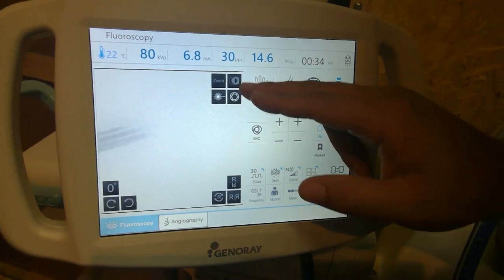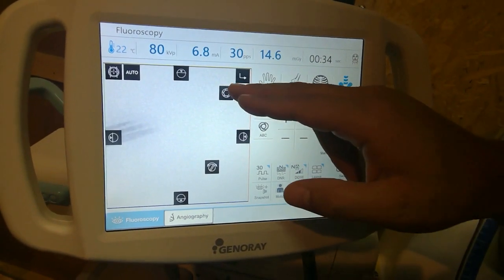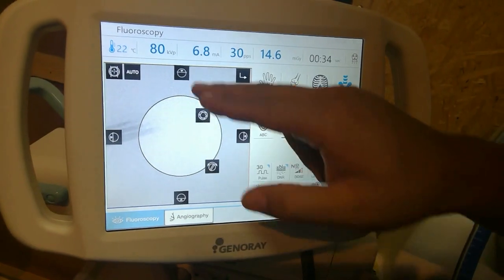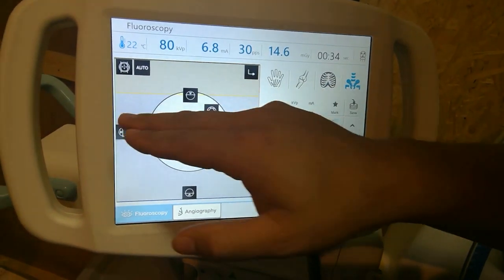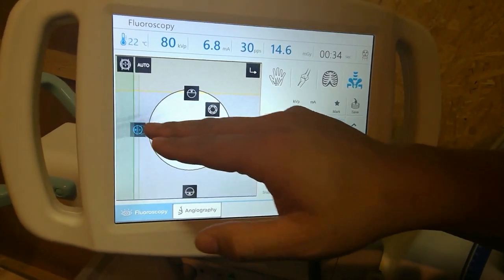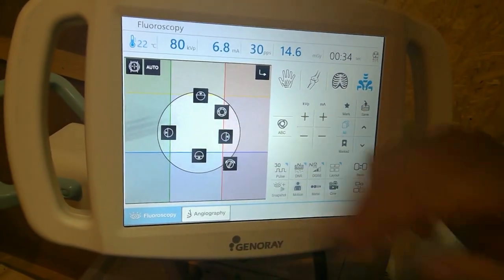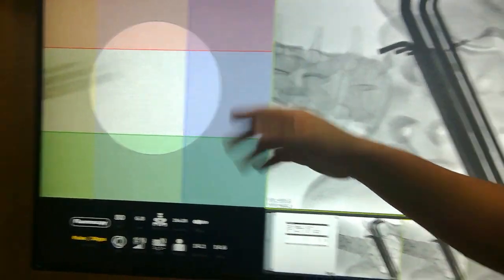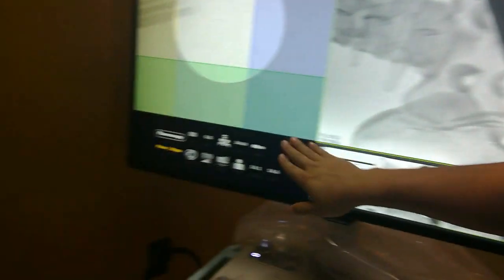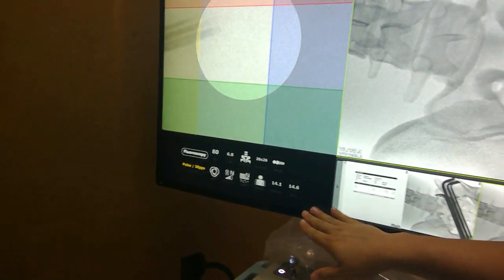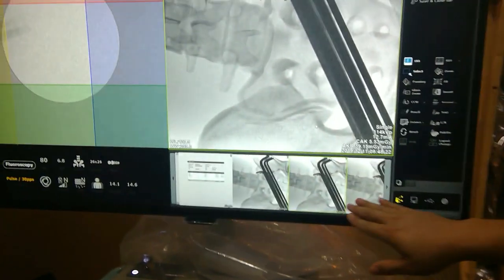One unique thing about this system is the collimator. This collimator is a different color-coded system to make it super easy to identify, which also shows up on the 43-inch 4K monitor the system comes with, with all the information that you need.